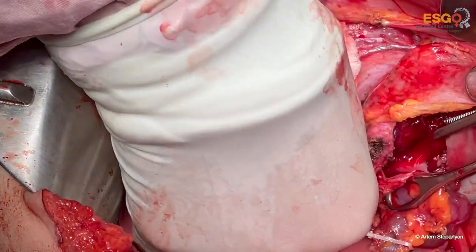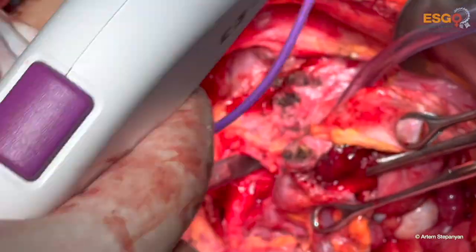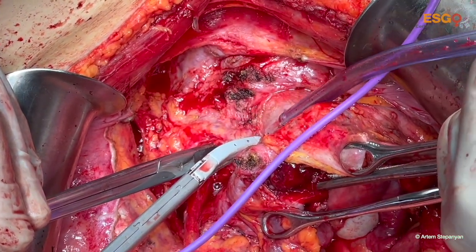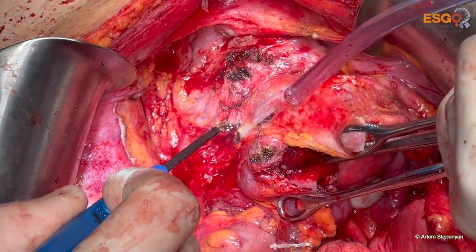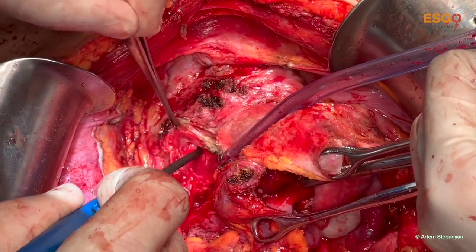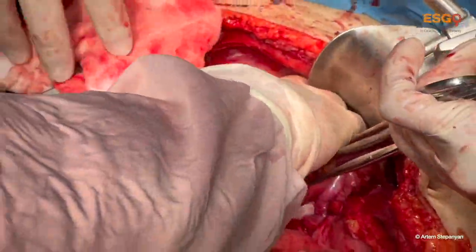And usually we prefer to mobilize the ureter until its entrance into the bladder. And here I will cut the uterine artery and the ureteral roof together in one piece. On the right side, we did it separately. It's not critical. The important thing is to see and to avoid the ureteral damage. Here we separate enough. I think we're safe.